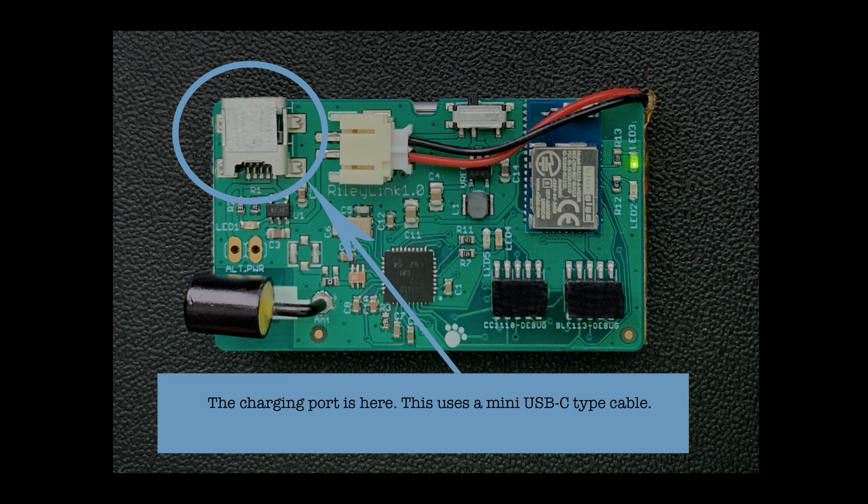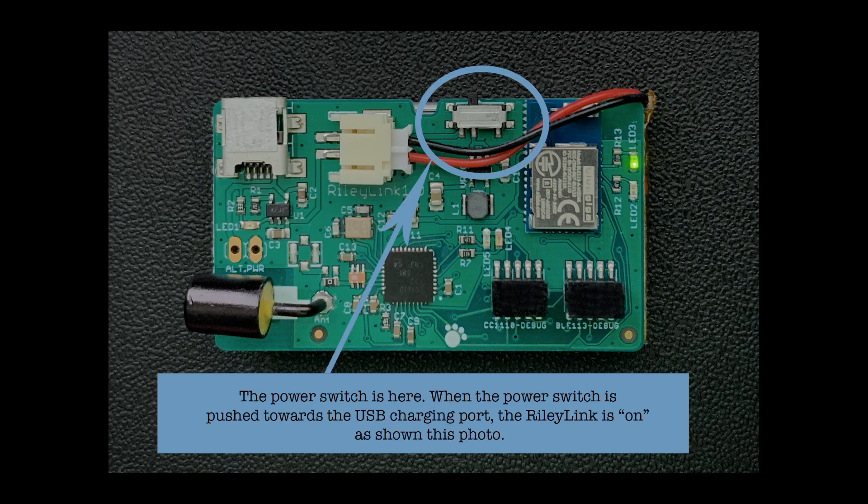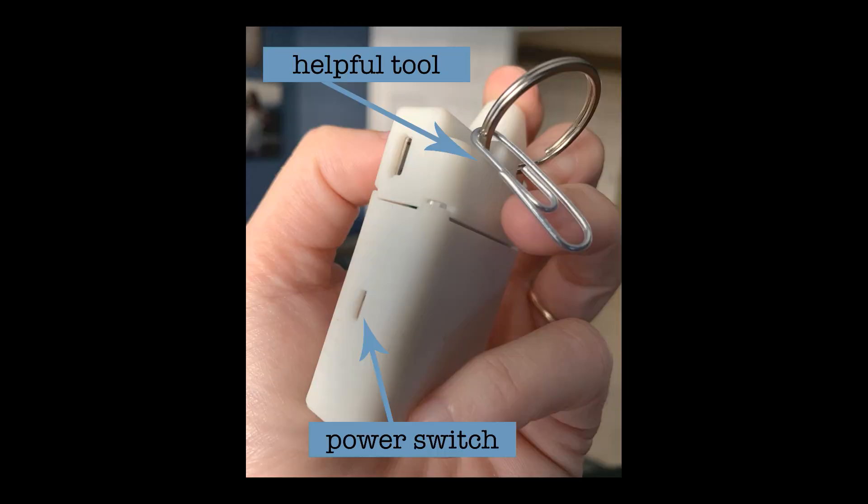There's a charging port on your board that uses a mini USB-C cord. Just plug that into a wall charger and your RileyLink should be fully charged in about two hours. The power switch is on the side of the board — when the switch is up towards the USB charging port, the power is on. The power switch is recessed to prevent it from accidentally getting broken off. Toggling the power switch is a common troubleshooting step if you have a red loop or your loop stops working, so you may want to carry a small pokey object like a paper clip to reach that recessed switch.